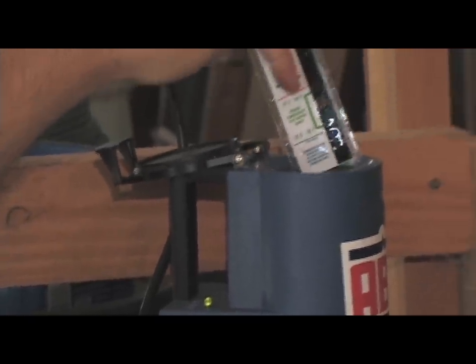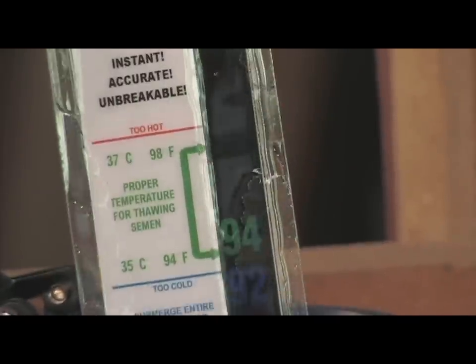You can check it with that little piece of plastic in there — it'll glow and tell you. The optimum temperature is between 94 and 98 degrees. 94 is what you want. See it right there, 94? So we're ideal. I left it in there for one minute — no more than three minutes maximum.